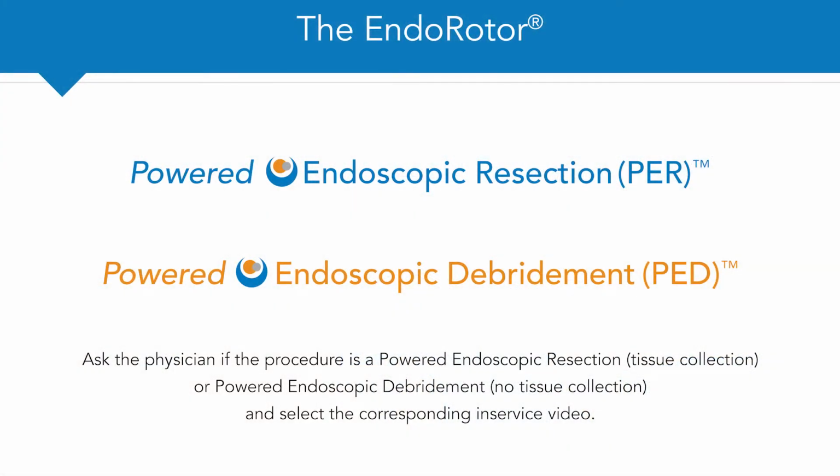Ask the physician if the procedure is a powered endoscopic resection, tissue collection, or powered endoscopic debridement, no tissue collection, and select the corresponding in-service video.